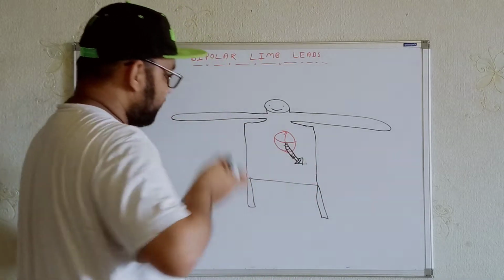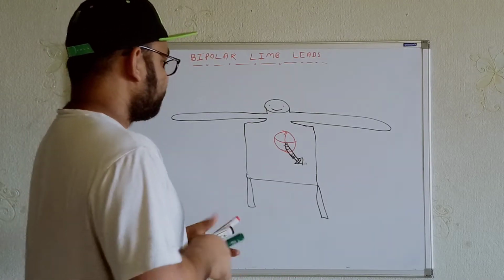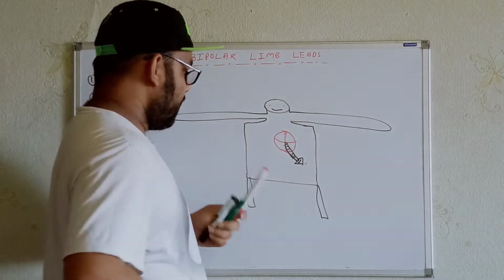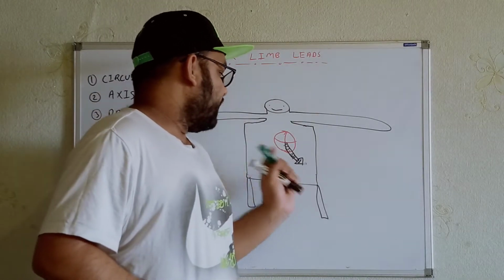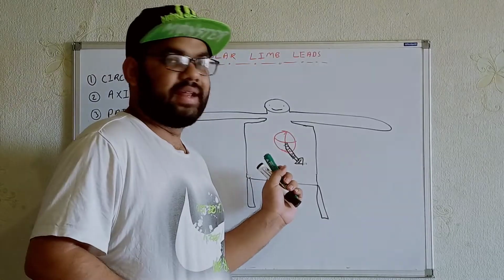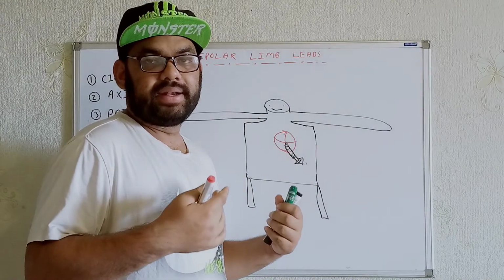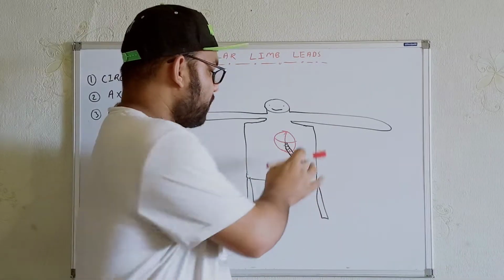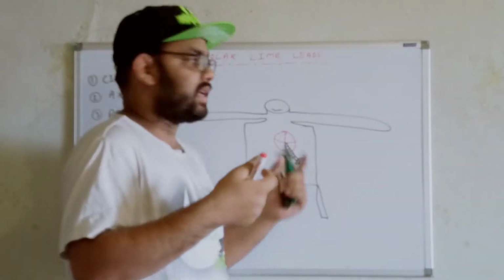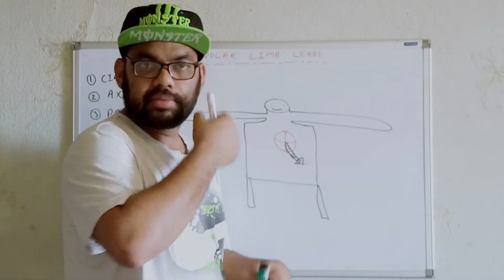Now to measure the vectors, we can use different kinds of leads. For example, I can use the lead over here. Try to understand from this that the electrical impulse will arise over here. As a result, from the heart the electrical activity will spread all over the body, in the upper limbs, the lower limbs, and the trunk. Everywhere you can see this.